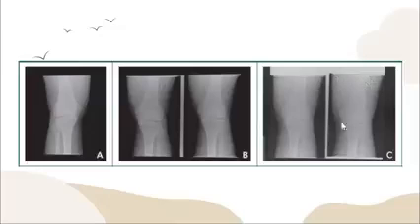Okay? Hiwi pagid ni siya, tapos dili tarong ang collimation per view. Okay, dili sila the same. So mo akong ingon, medyo puti siya. So that is why ang buhaton na lang nato is one view per plate na lang natong gamiton. Okay?